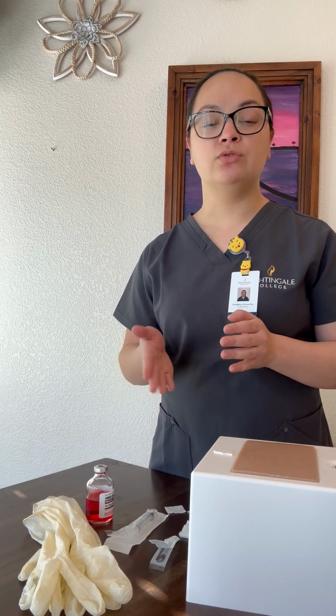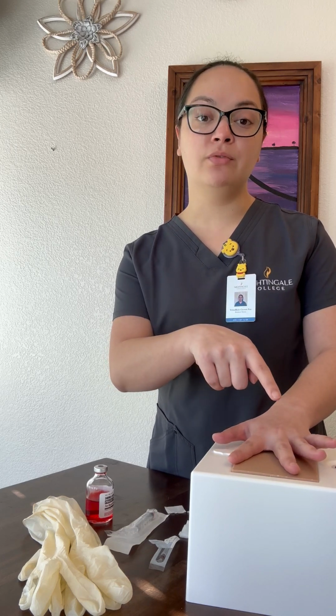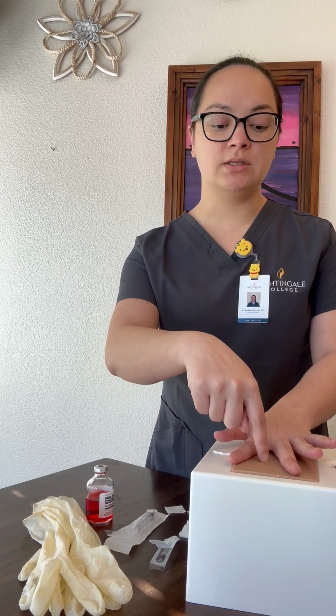So for the intramuscular injection, to locate the site, we're going to do the ventrogluteal site. We'll place the palm of our hand on the patient's greater trochanter. The thumb will face the patient's groin. Our index finger will face the iliac spine, and our middle finger is going to face the iliac crest. The center of that triangle is going to be our injection site for the intramuscular injection.